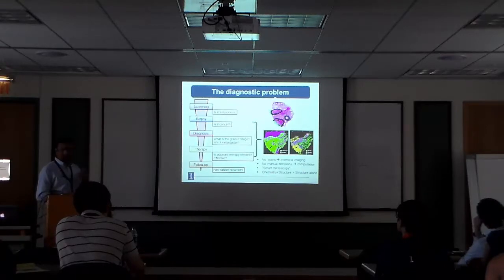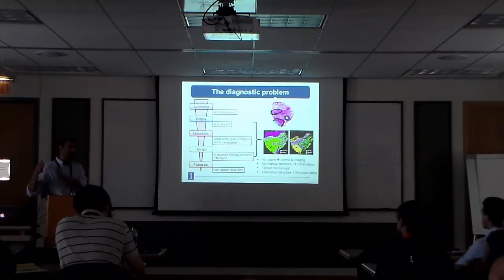The second thing, which was implicit in what I was saying, is that we are replacing this manual staining approach with computation. So there's a computer behind it that's allowing us to make these visualizations, which otherwise required a microscope and some dyes and stains and so on. The whole idea here is that instead of doing staining, sectioning, microscopy, human analysis, and then coming up with a decision, it's all done in one step, right? The microscope itself is the decision maker. The microscope itself is the stainer in that sense.